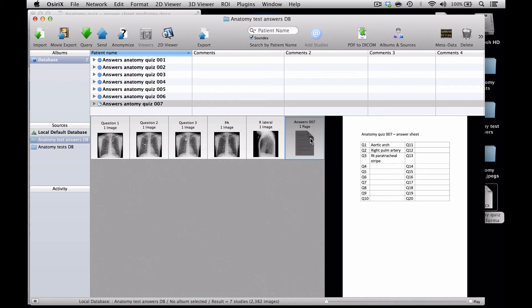So what I've shown you today is how you can use OSIRIX to put arrows onto images and create interesting sets of questions that students can look at on their own, and then look at the answers either on their own with the answer sheet or as part of a group tutorial. I hope you found that useful. Thank you.